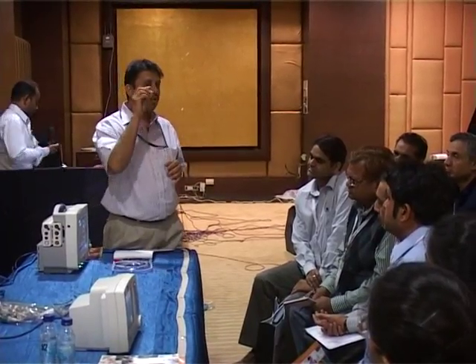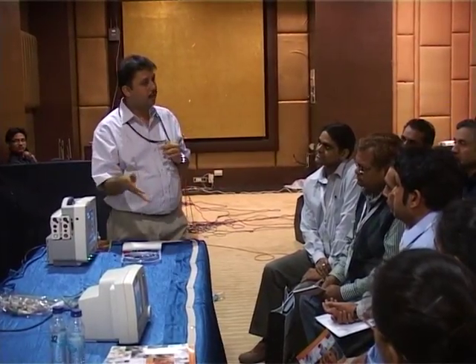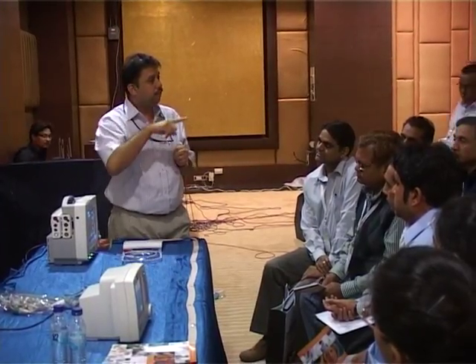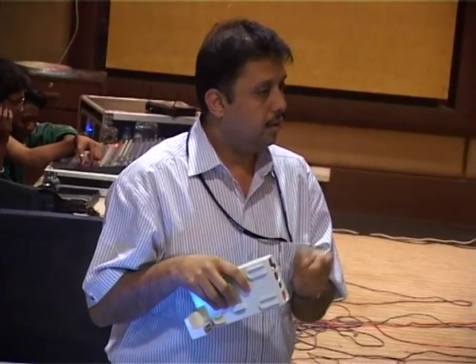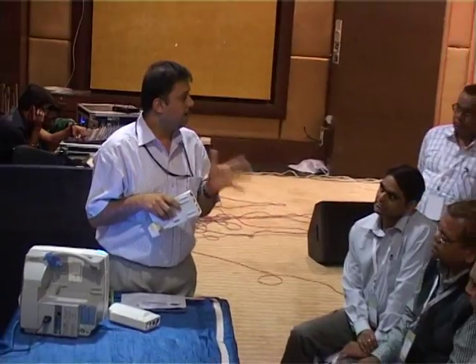Cardiac output. And for transpulmonary thermodilution, we inject a cold solution into the right atrium through the central venous line, but measure it in the arterial line. So it completes the complete transpulmonary phase. And now when we talk about the continuous cardiac output, the machine also has the capacity of measuring thermodilution, normal cardiac output with the help of Swan Ganz.